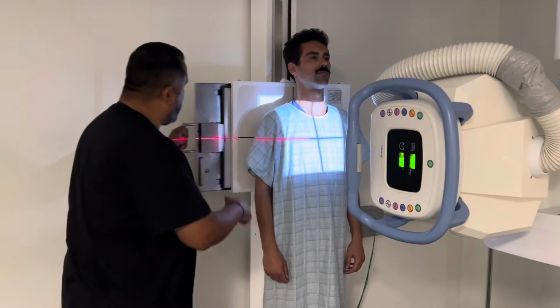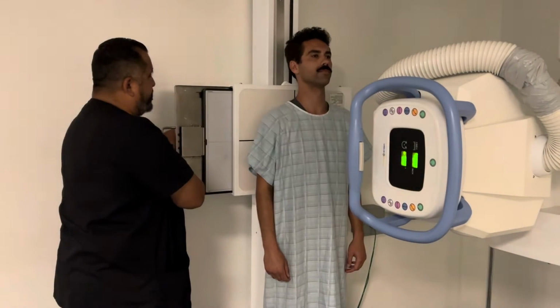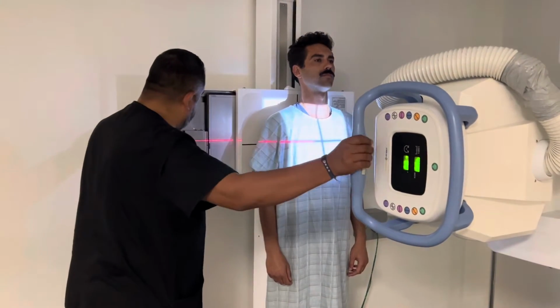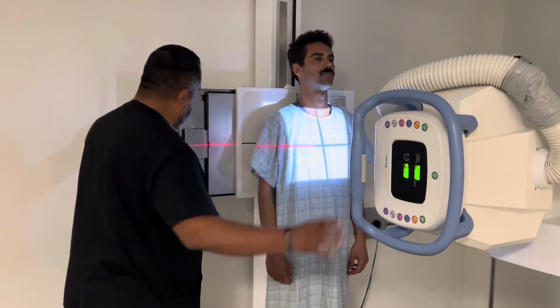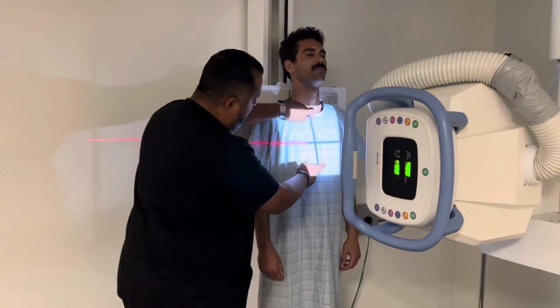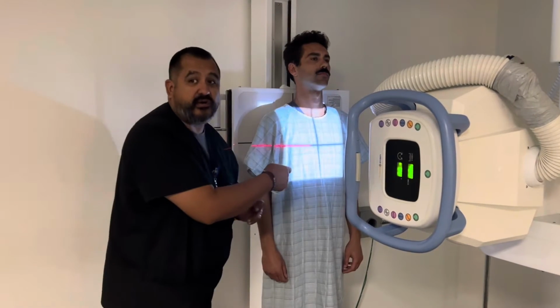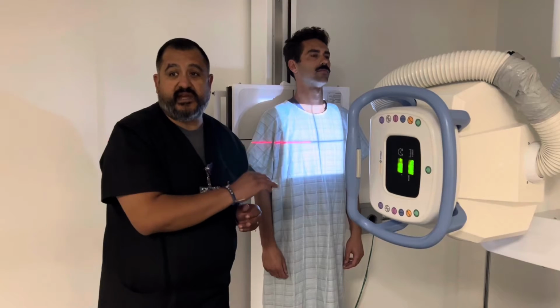I want to make sure I'm at the level of T7. I'm going to come down just a little bit, like a hair. Watch it back here, sir. Do this here. And I want it in the mid-sternum. Here's his jugular notch, here's his sternum. I can see that right there, you guys. So we're mid-sternum. This is the level of T7.